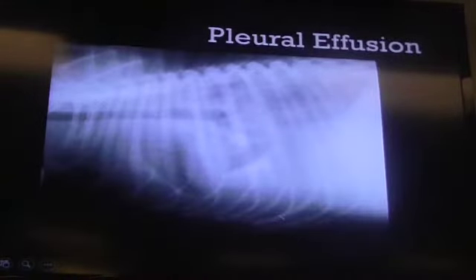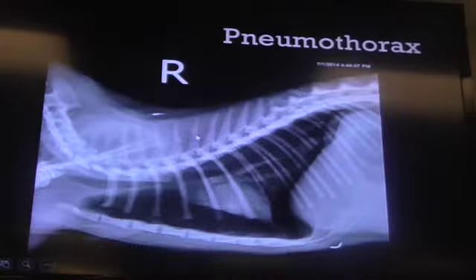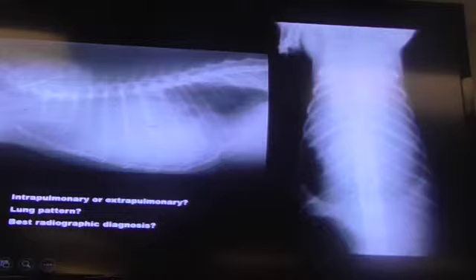Here you can see that even though there may be some slight displacement of the trachea, it's not hanging out next to the spinal column. So there has to be something other than fluid. That's why I say, is there a mediastinal mass? Maybe this patient has lymphoma and they're just big lymphoid structures sitting right here, and all of this is pleural effusion that's obscuring the cardiac silhouette.